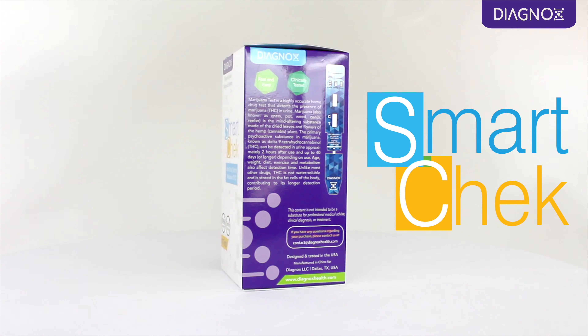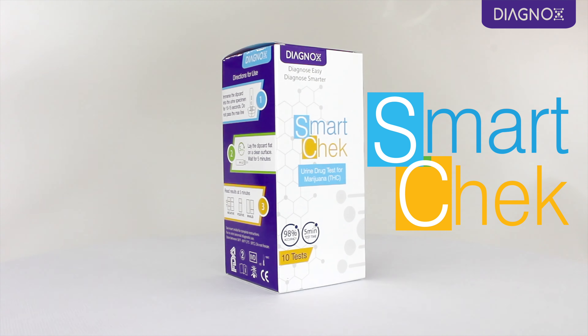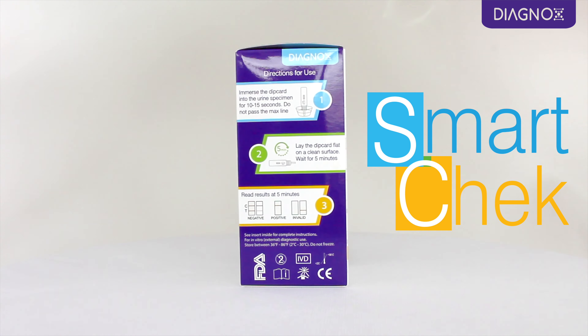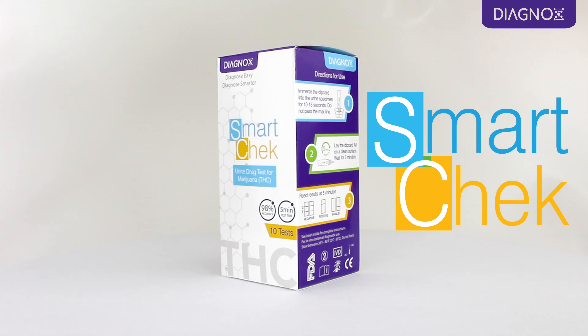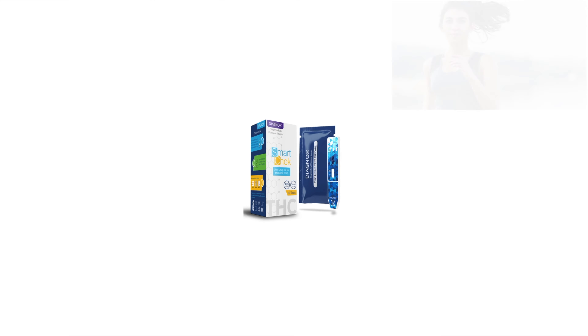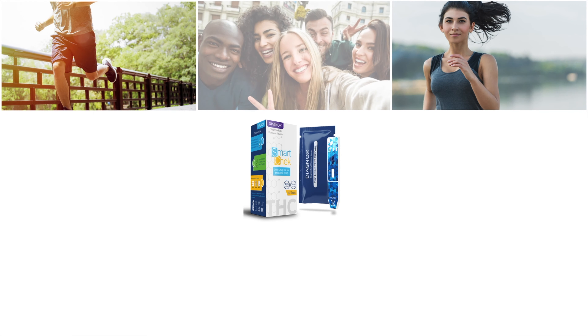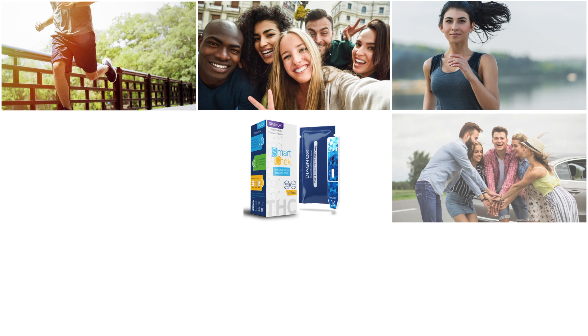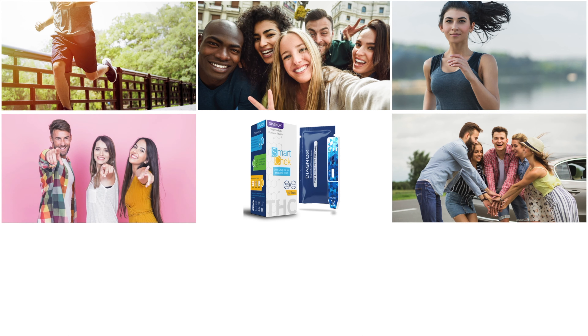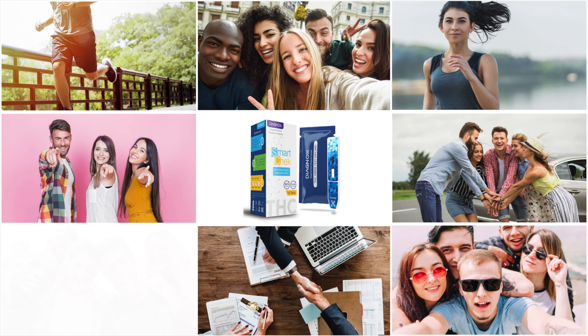SmartCheck from DiagonOx is a versatile series of drug screening tests for personal and professional use. The THC Dip Card is a quick and easy urine screening test for marijuana. The test is CLIA-waived and FDA-approved for over-the-counter use, so that you can run a screening test from the privacy of your home with clinical-grade accuracy in as little as five minutes.